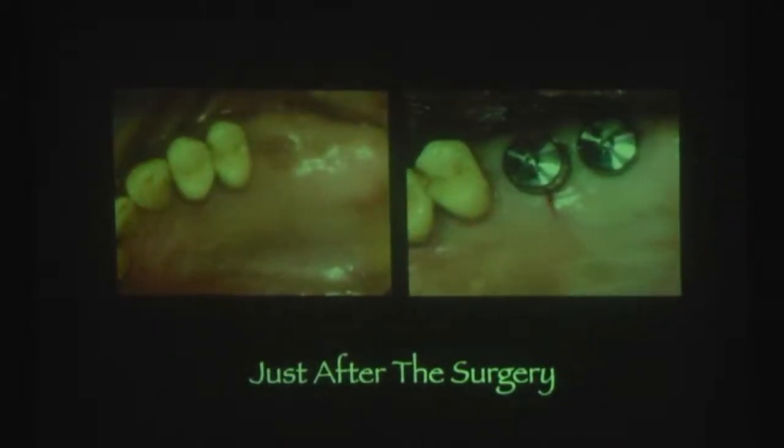Again, this is just after the surgery. I placed implants and put the gingival healing abutment. You see here, when making the punch out, the scalpel went in the wrong direction. But this is the only part.